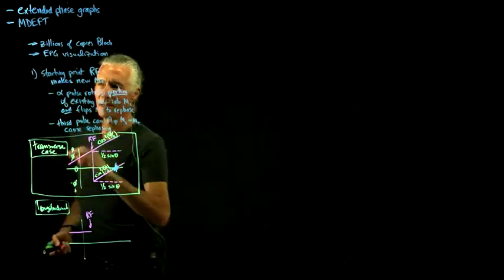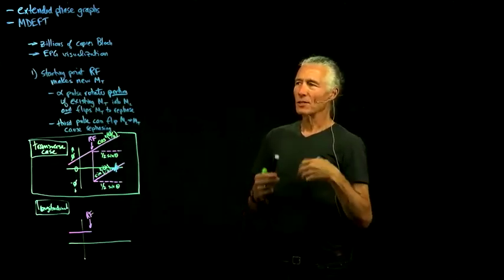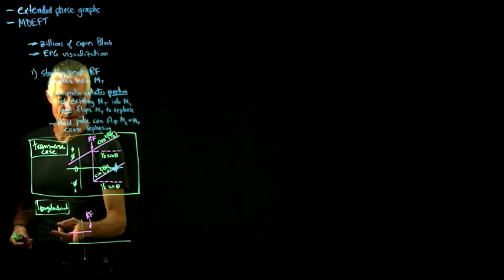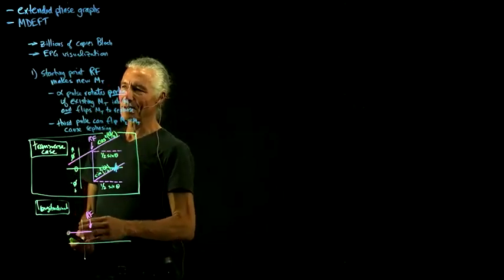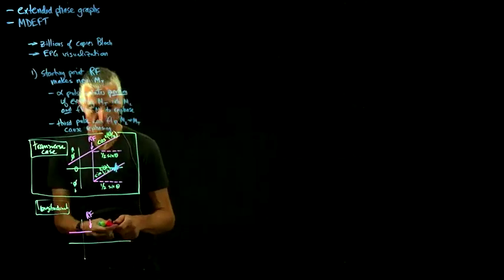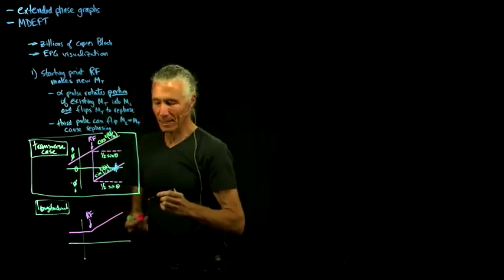The starting point was there's no transverse, and we just generate some transverse with the RF pulse. But this is talking about if we've got some dephased, saved longitudinal. In that case, we'll turn some of that into transverse, which will then start to dephase.